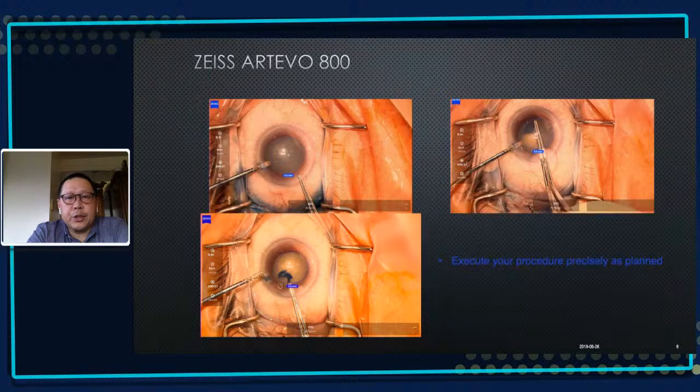Now, these are just pictures of the Rexis guide and how I was able to follow it, because like you are looking at it now with both eyes, I was looking at it also with both eyes. Not just on one ocular and trying to follow it. Sometimes when you have something on one ocular and the other eye is looking at something else or has a different image, you have some form of visual confusion and it kind of sets you off. But now, since you're looking at a big screen, it's in 3D, you're using both your eyes, I think it makes it so much easier.